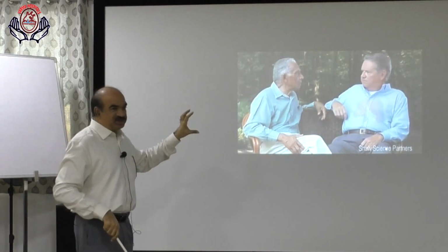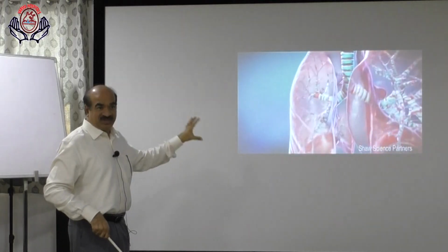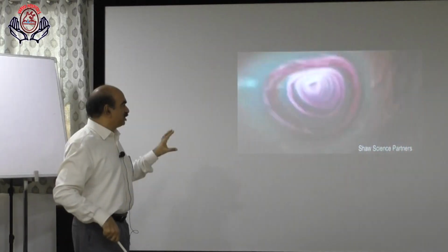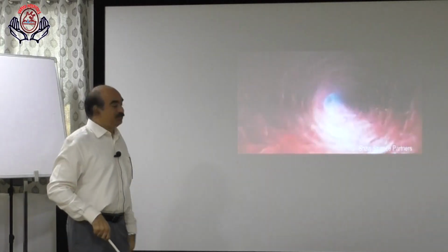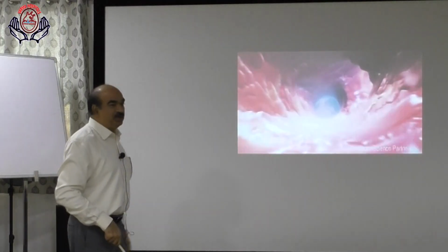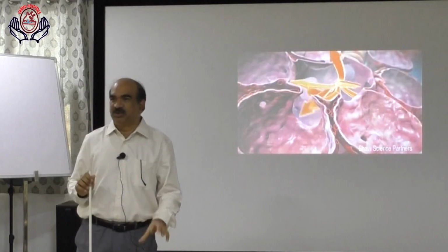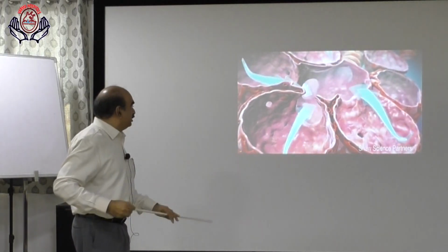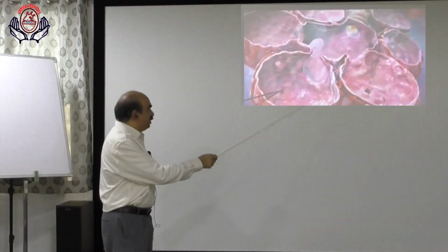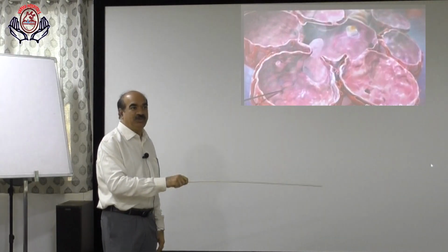So we should look at the patient's lungs. We should check the amount of airway resistance and compliance. We should mainly focus on airway resistance and compliance. We should peep into the lungs before setting PEEP, into the airways and alveoli. If there is interstitial edema, we should maintain positive pressure in the alveoli. Alveolar pressure should be positive.